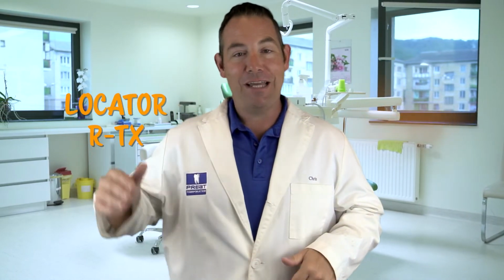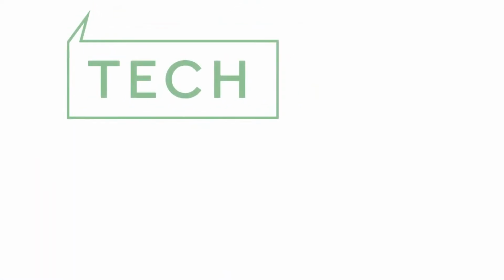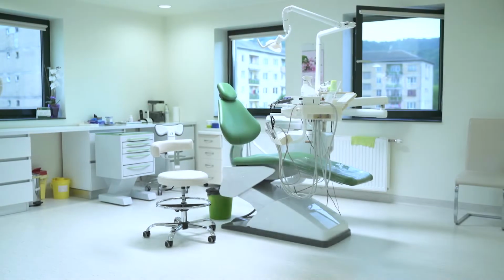Today, we're going to talk about the difference between Locator, Locator RTX, and Locator FTX. We heard this question quite a bit last weekend at Lab Day West. The question often comes up: well, what's the difference with this Locator and the RTX and the FTX? Well, I'm going to answer that here for you today.